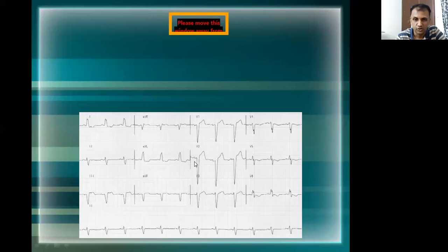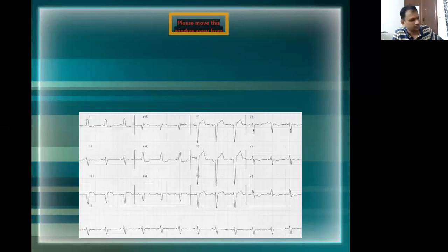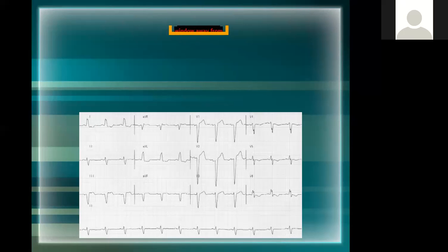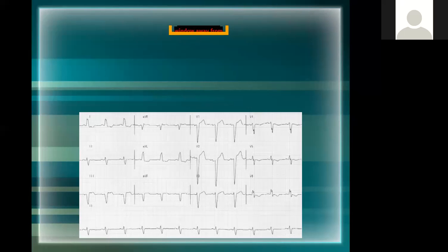Do you all think this is a normal ECG? Yes or no? No, sir. Good. Why do you say no? We just discussed it. Any takers? ST elevation. Good. Which leads? V1, V2. Excellent. Anything else? T-wave inversion in multiple leads. Okay, so it's not a normal ECG.